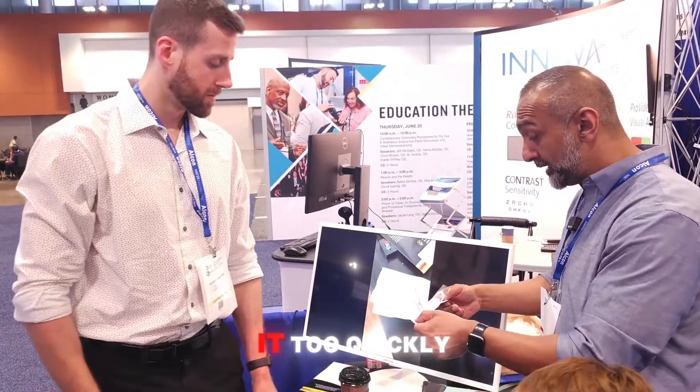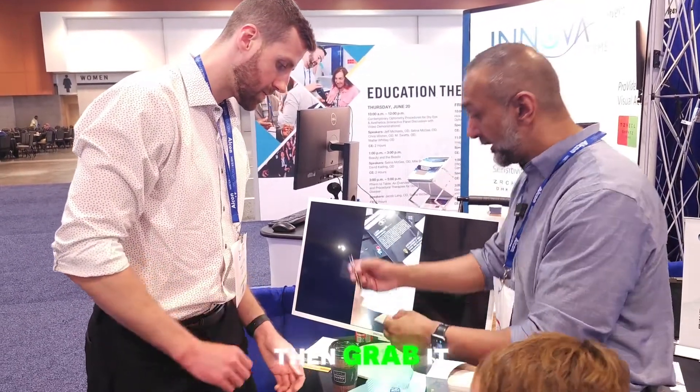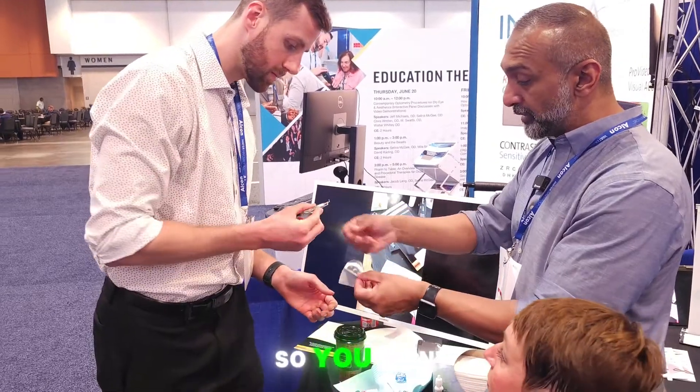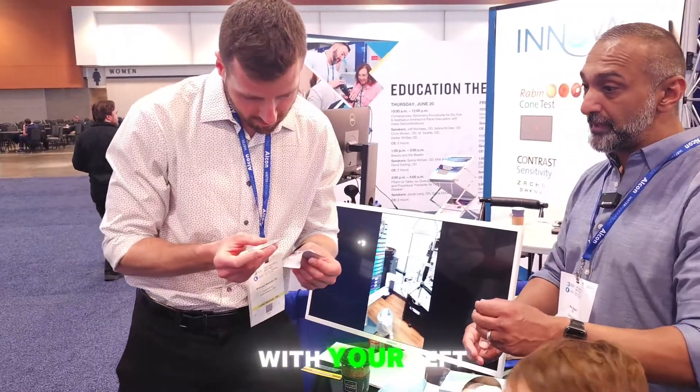If you open the package too quickly it'll just go in the air, so try to open it just enough to where you can then grab it. I've already cleaned this for you — grab the edge and you're going to try and place it.